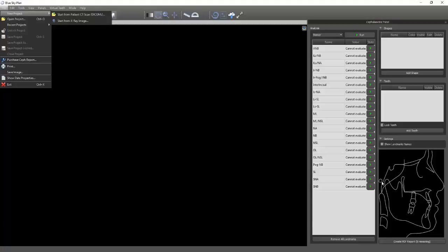So in the condyle up here and the sella and so on — you're going to want to keep in mind that a traditional ceph is the easiest to work with, but the software is able to work with both DICOMs and a single JPEG. If you just export your ceph from your normal imaging software and save it as a JPEG, you'll be able to open it up right here.